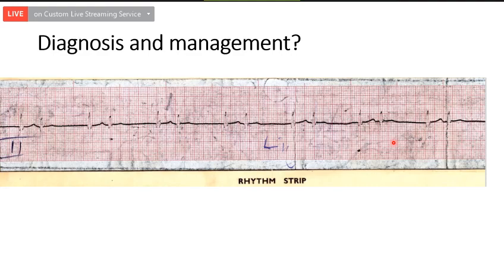I will repeat. One, alternating ectopic beat with normal beat. Two, 3:2 Mobitz type 1 heart block. Three, atrial flutter with 4:1, 2:1 conduction. Five, sinoatrial wenckebach. Six, escape capture bigeminy. And seven, echo capture bigeminy. So these are the conditions which can lead to bigeminal rhythm. Bigeminal rhythm means two beats are coming together.